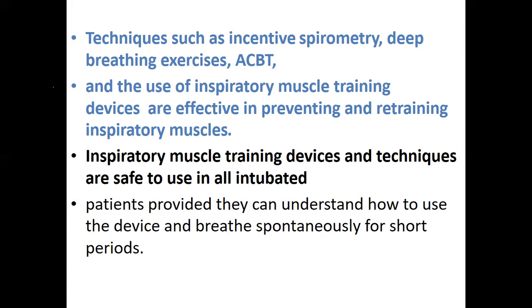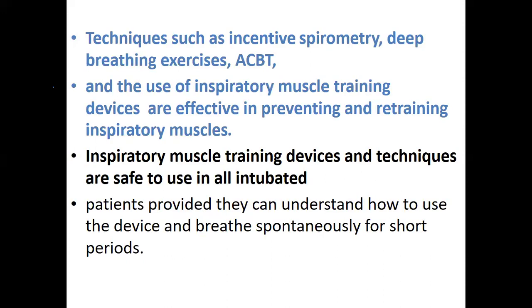Inspiratory muscle training devices and techniques are safe to use in all intubated patients, provided they understand how to use the device and can breathe spontaneously for short periods. So this is about these techniques.